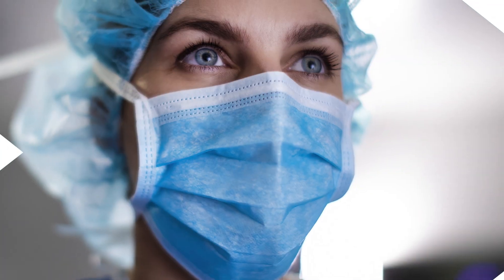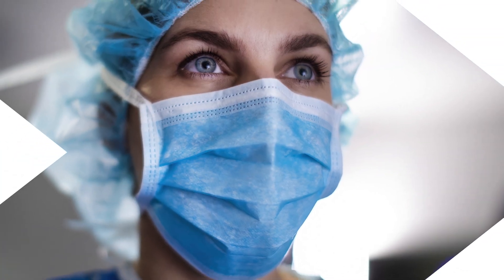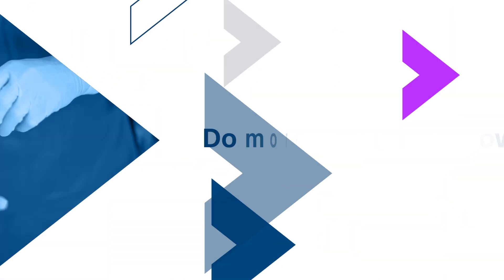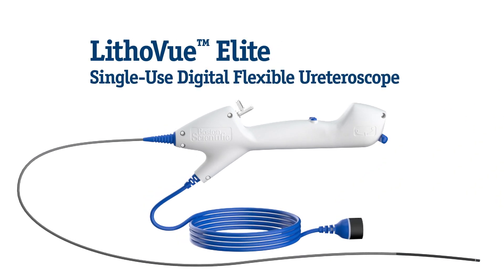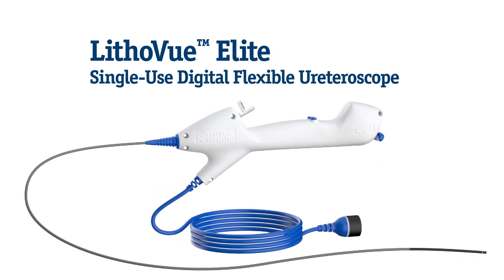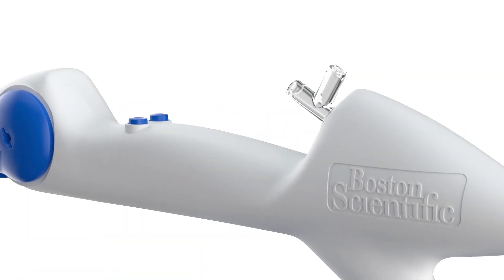Have you ever wanted more from your ureteroscope to access and treat kidney stones? To see more? Know more? Do more? Introducing the LithoVue Elite single-use digital flexible ureteroscope with intrarenal pressure monitoring. It's not an ordinary scope — it's more.